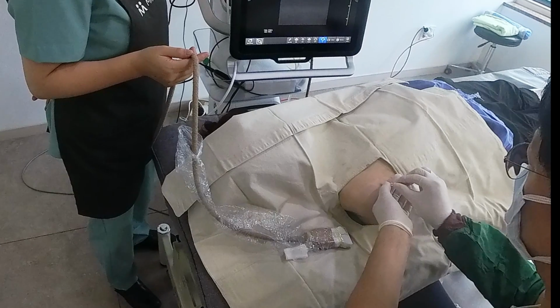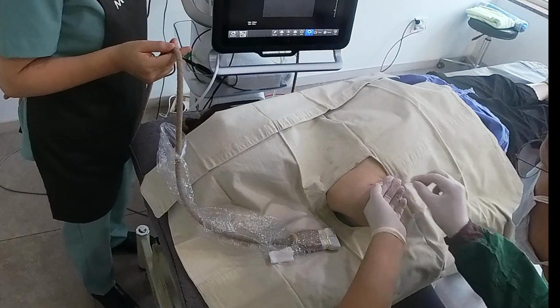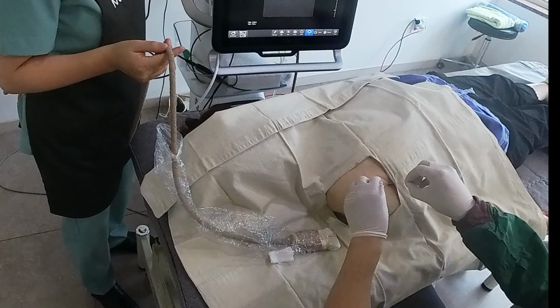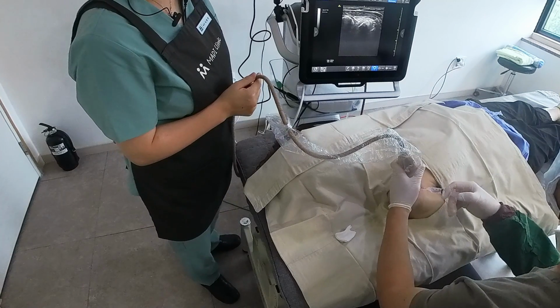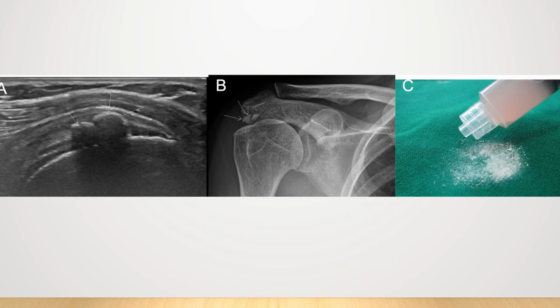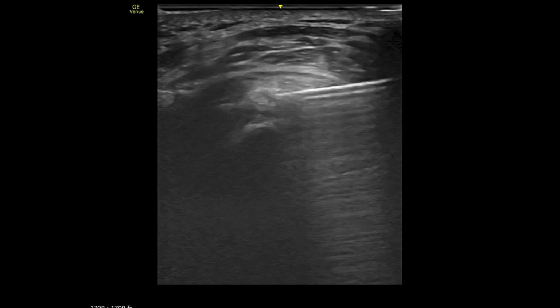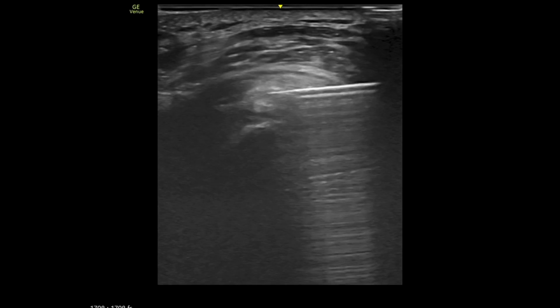Remove the obstructive calcium or soft tissue. Occasionally, the needle may be obstructed by a calcium plug. Use a 24-gauge stylet needle to remove the plug and soften hard calcium. It facilitates the irrigation process. Calcium fragmentation. Within the vesicle, the calcium closely resembles dry, compacted sand, adhering strongly to particles and the inner walls. To facilitate irrigation of the calcium in the cavity, it's imperative to utilize the needle tip not only to break up the calcium mass but also to stir and glide within, ensuring detachment from the vesicle boundaries.